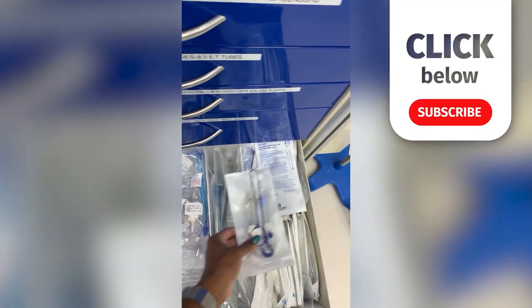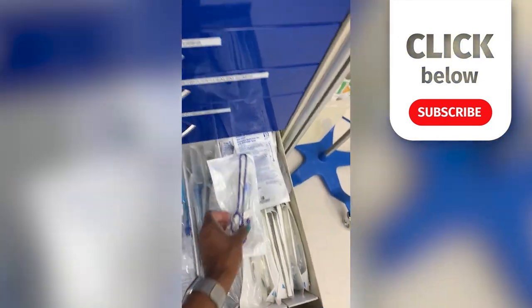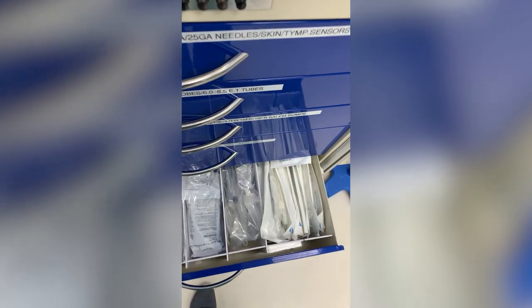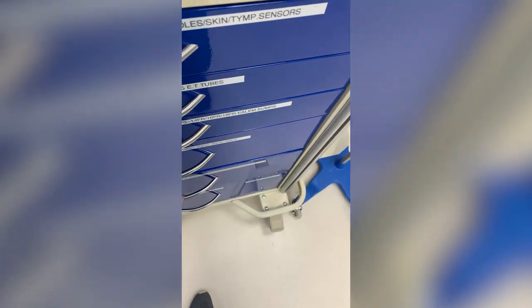This is kind of our standard tubing that I showed you first. This is tubing to connect to other medications. So IVs are really important to anesthesiologists. As you can see, we have a lot of different types. So we use them pretty much on everybody.